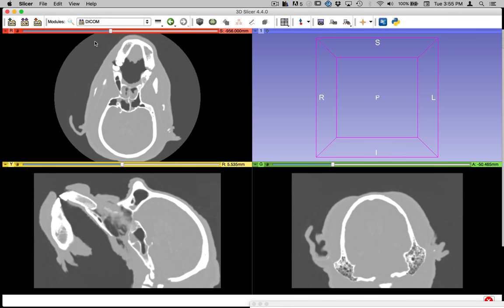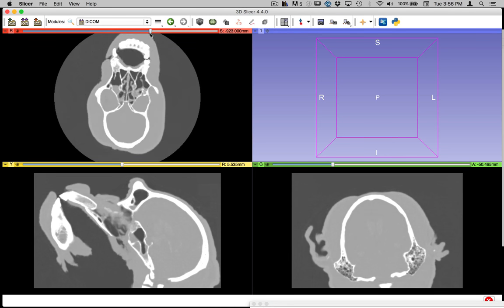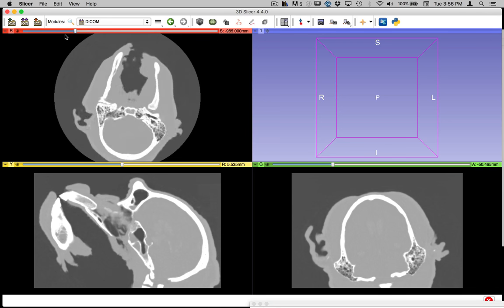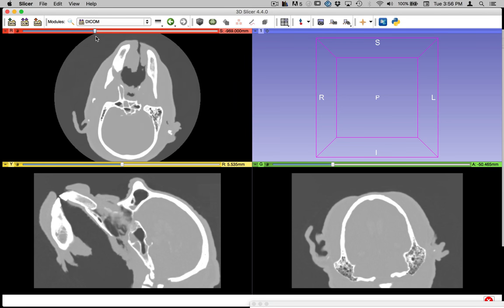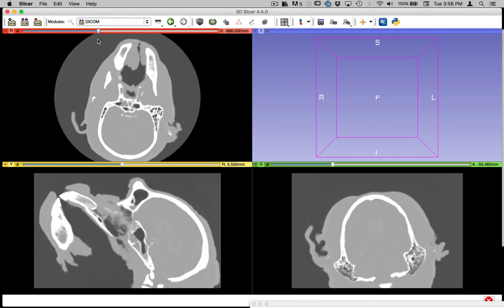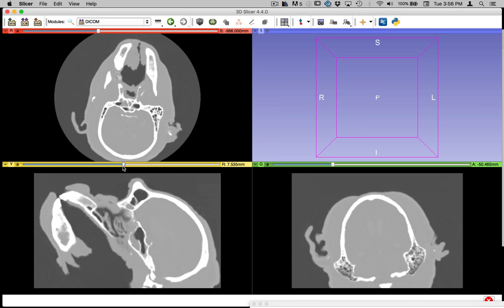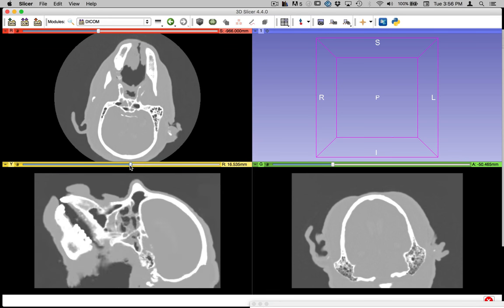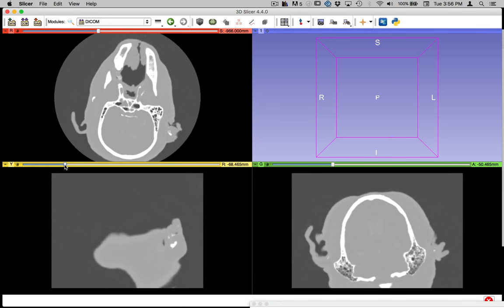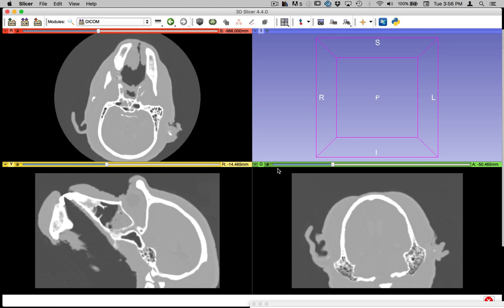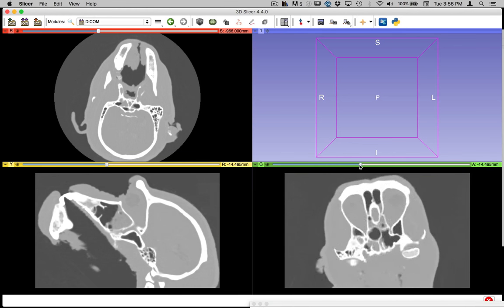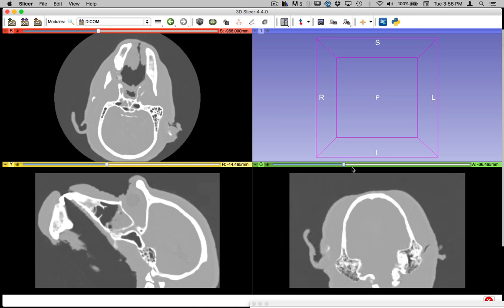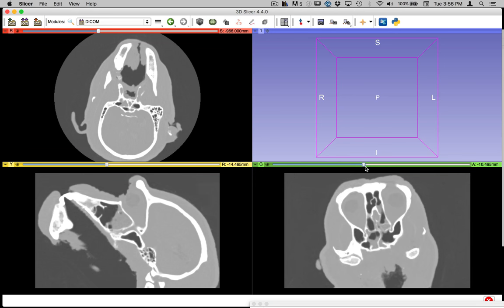So you can see that I can scrub through the stack of images in these different sections. So this specimen wasn't physically sliced, but the x-rays generate sections in all dimensions like this. So we can view in all of these different transverse coronal and sagittal sections.